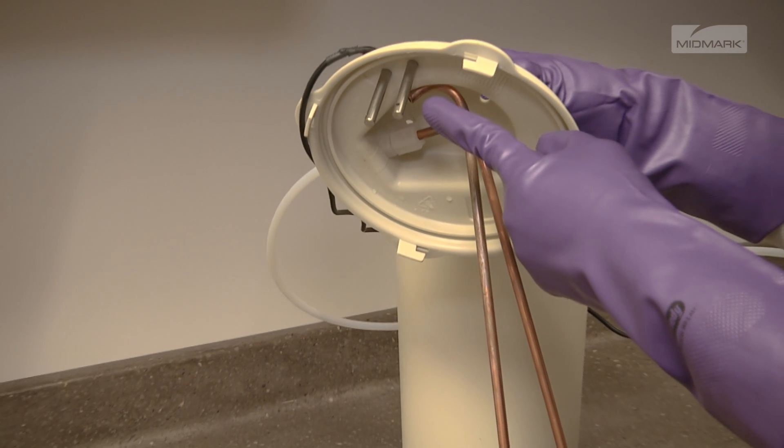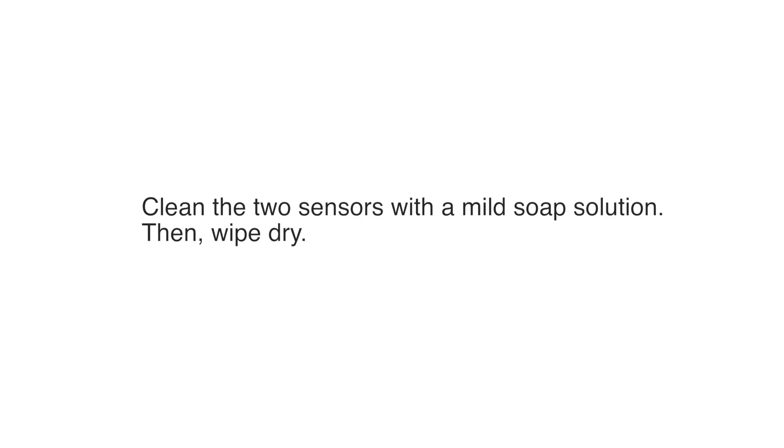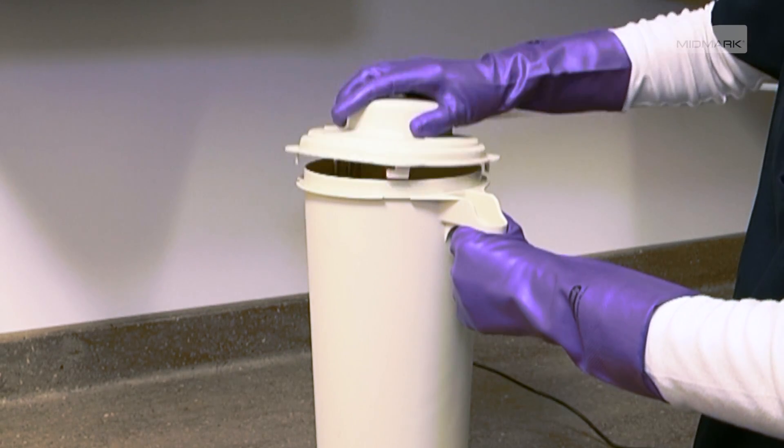The condensing tank level sensors can be found on the underside of the condensation tank lid. Clean the two sensors with a mild soap solution, then wipe dry. Replace the lid on the tank and secure.